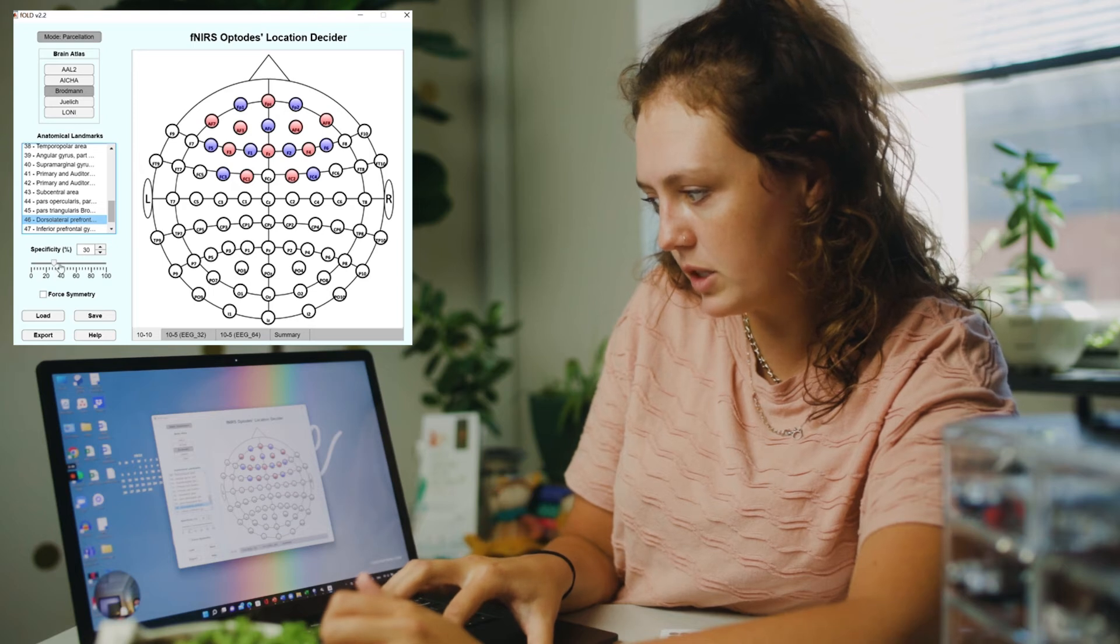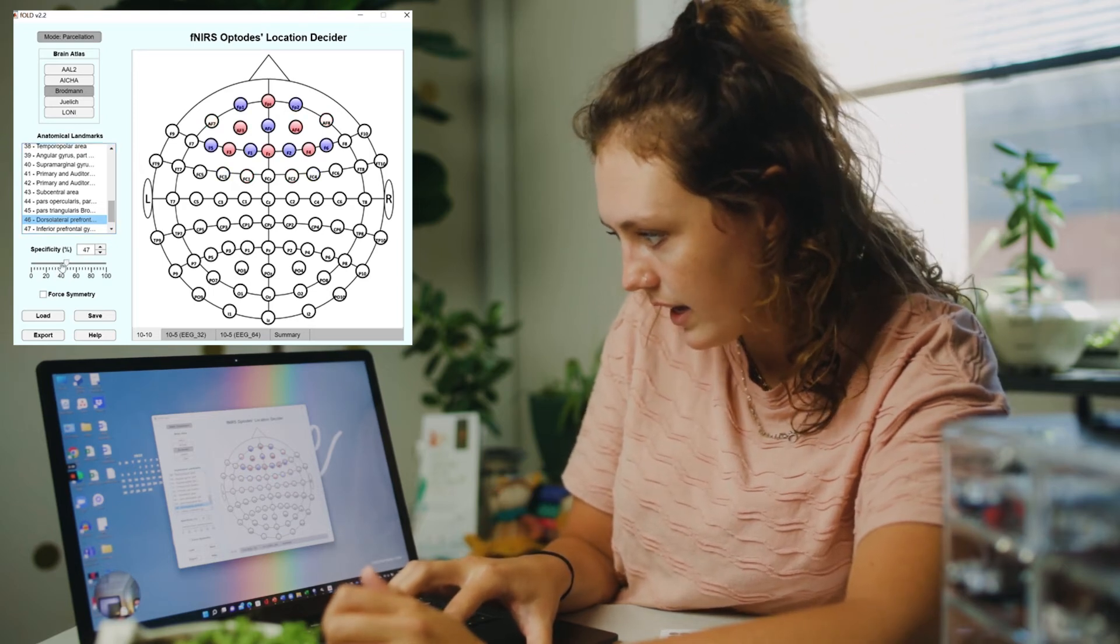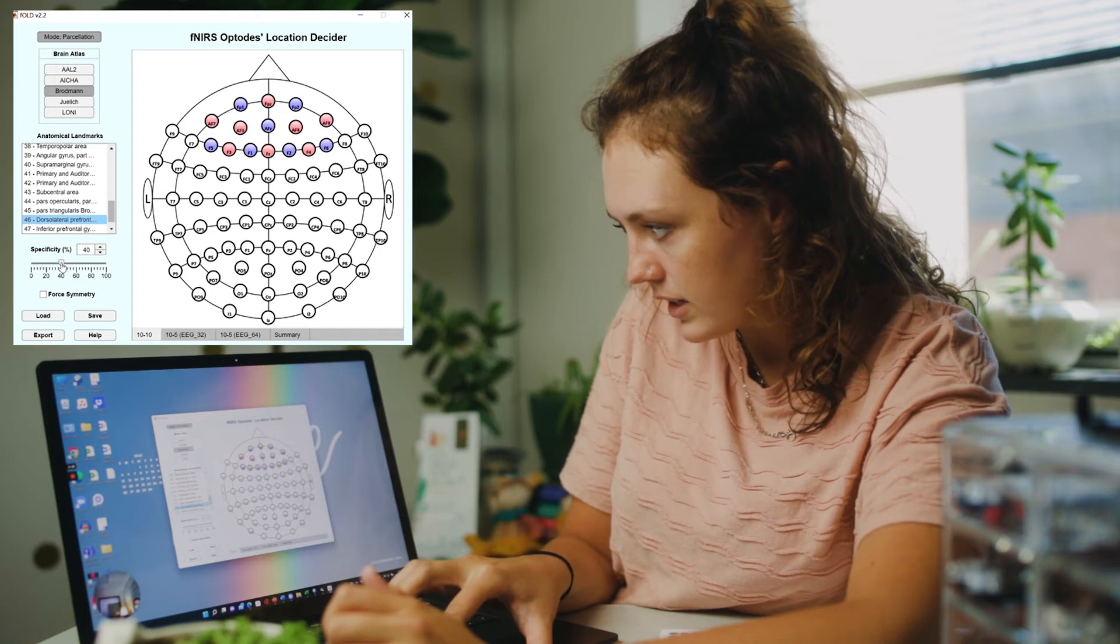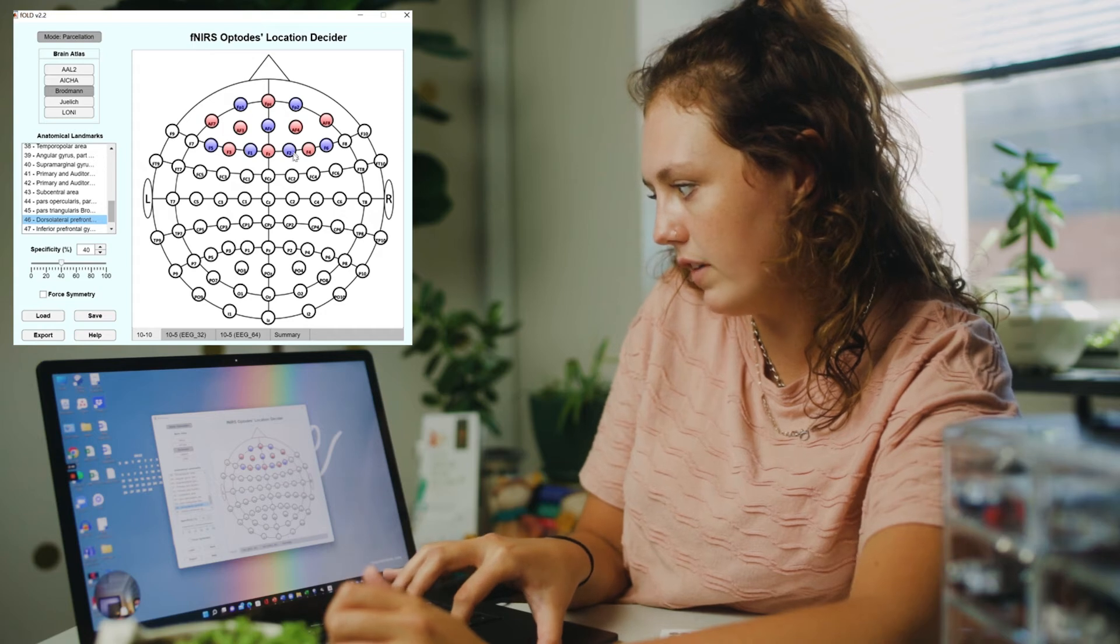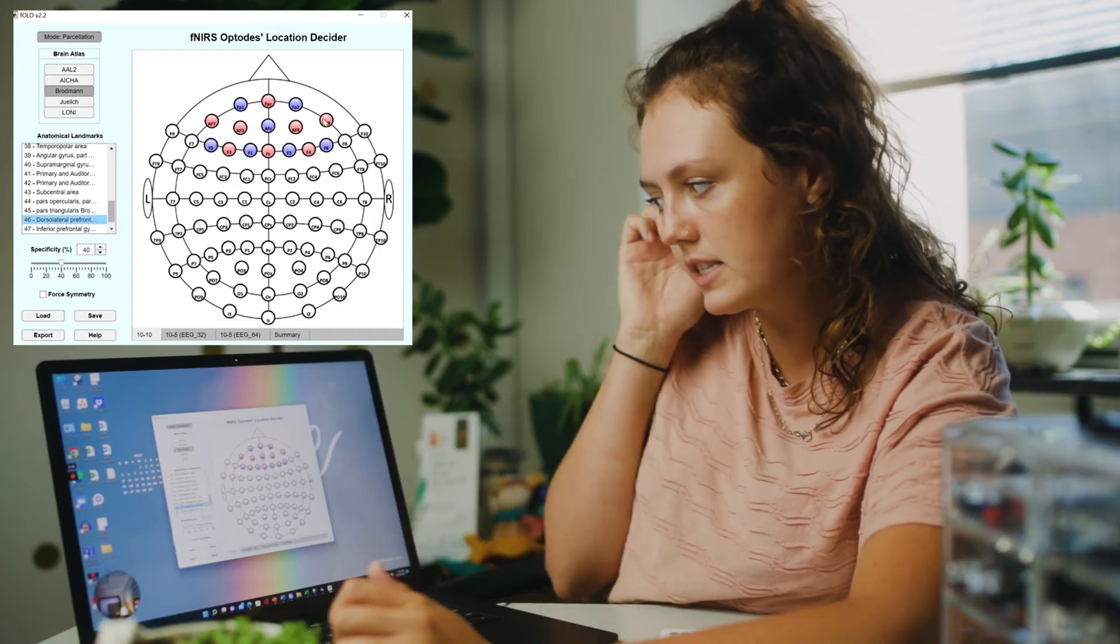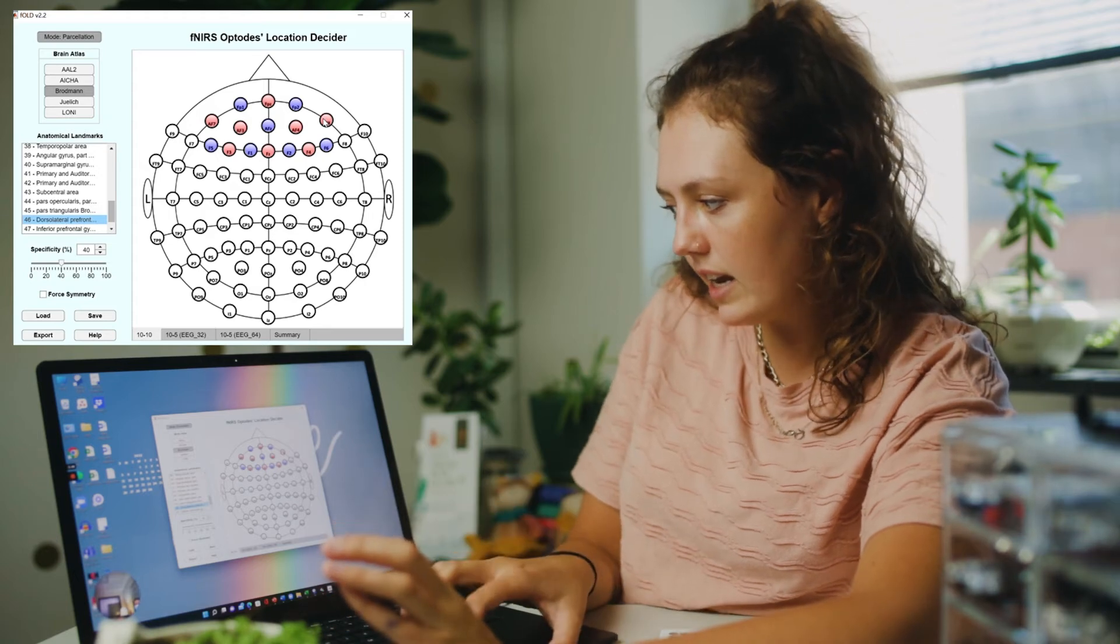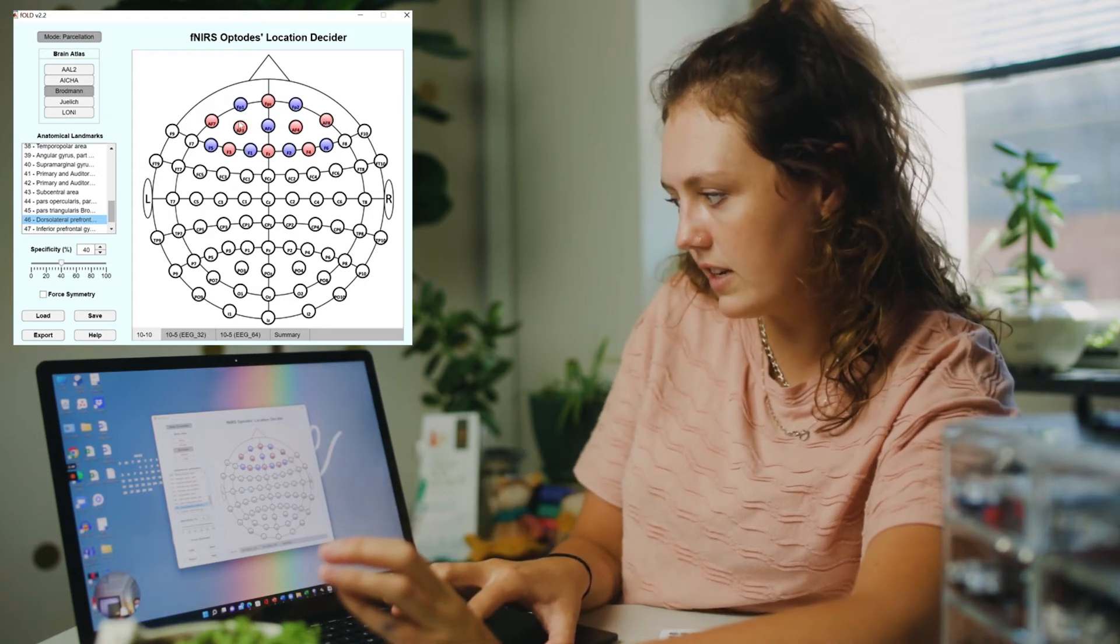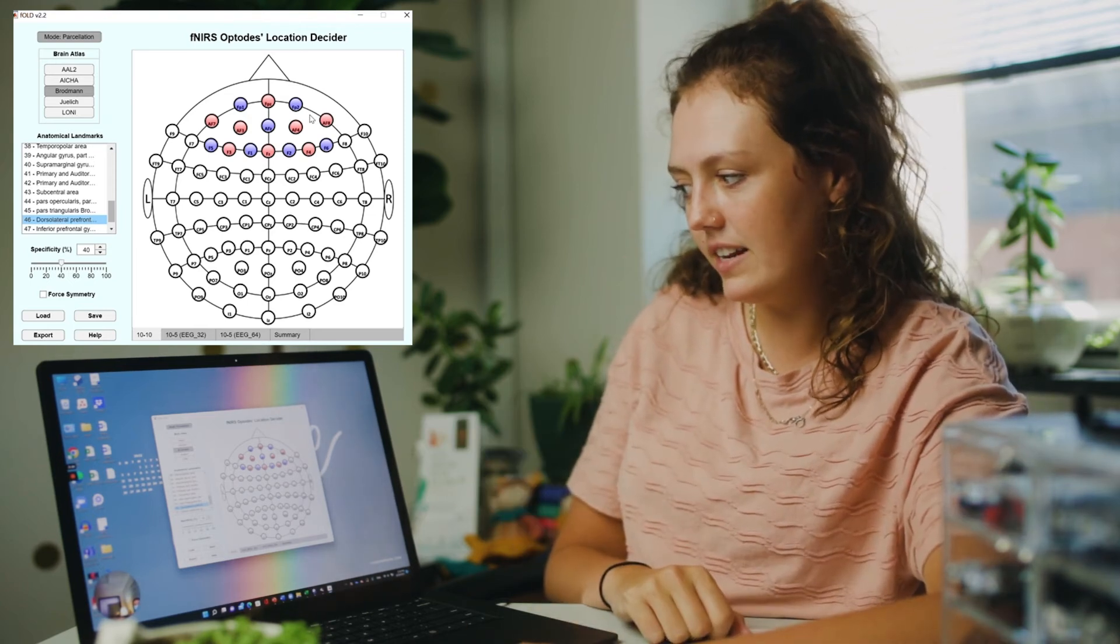So I'm going to adjust my specificity. Okay, that's too little. I think this is a perfect amount. So we have 1, 2, 3, 4, 5, 6, 7, 8 sources. That's the perfect amount of sources that we need. And we have 1, 2, 3, 4, 5, 6, 7, 8 detectors. So that's exactly the configuration that we need.